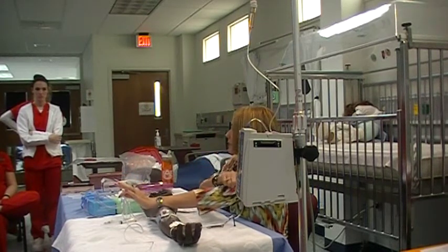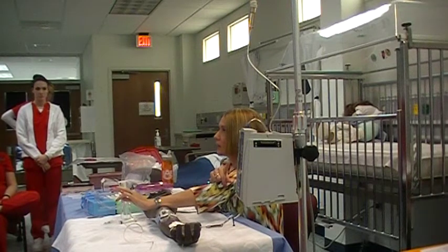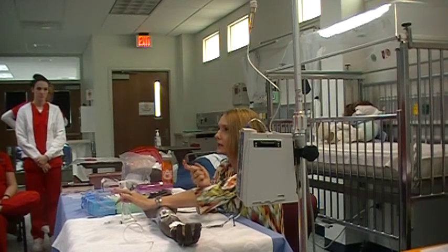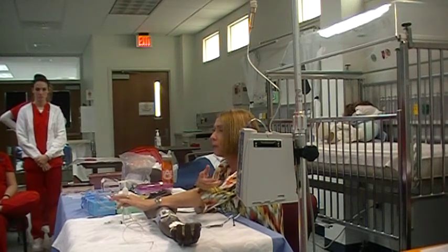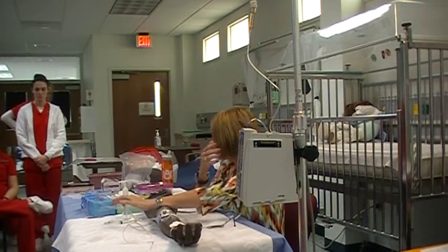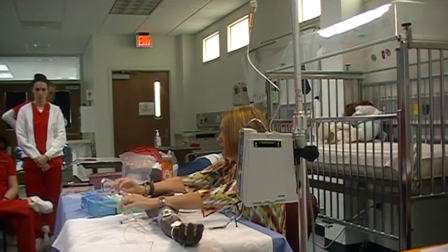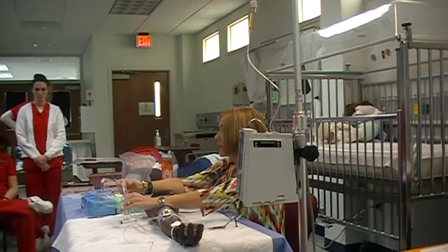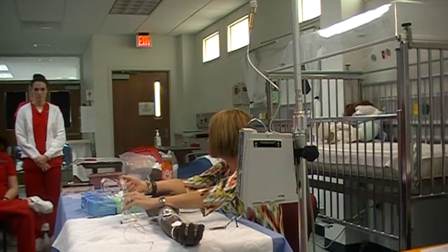Now this thing by this point, because we're kind of slow, is already beeping at us and hollering. And I'll just come over and I'll silence it for you guys. So I'll be standing there watching you and helping you out, because again, we want our patients to be confident in our abilities. So then once we've occluded that, we're going to put our medication, whatever we've drawn up, we're going to give it at whatever rate we decide. Now Lasix, does anybody know how fast we can give Lasix?